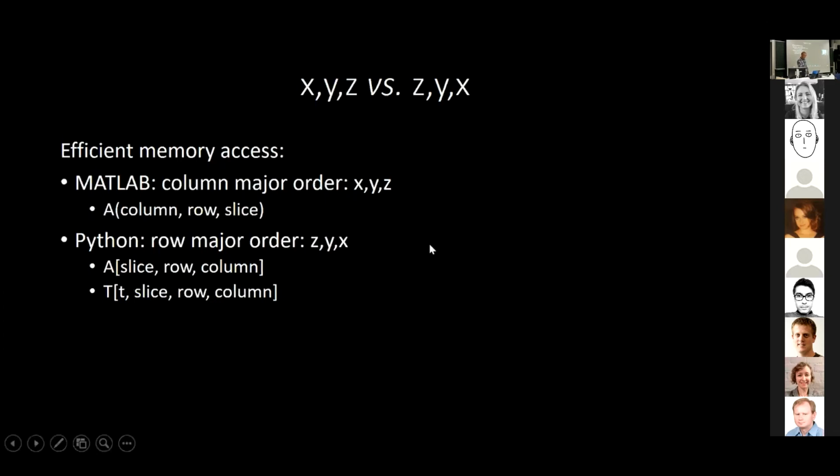So it's slice, Y, and X. Or maybe it's not slice, Y, and X, because what is X, Y, and Z? You're thinking of a coordinate system, X, Y, and Z. Relating to what? DICOM is typically the scanner coordinate system. In NIfTI, it's more like a patient-centric coordinate system.